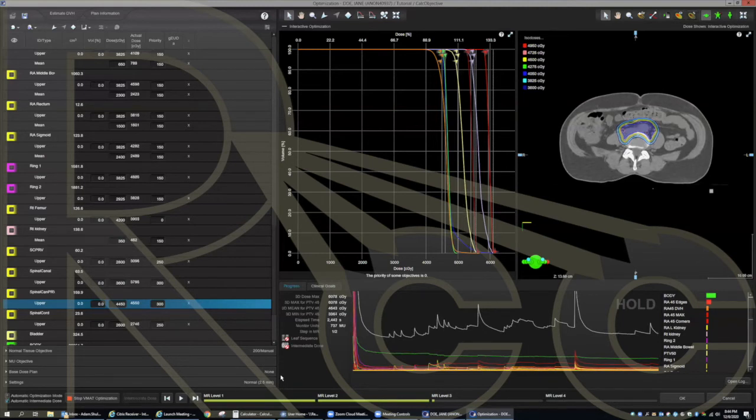Yeah. Exactly. And when you're doing a head and neck case, especially one with optics involvement, sometimes you got 20 organs at risk that you're tweaking one by one. So it takes a long time, but if you do it in an early fashion. Yeah, exactly. If you got 3 or 4 SIB, all those organs at risk.